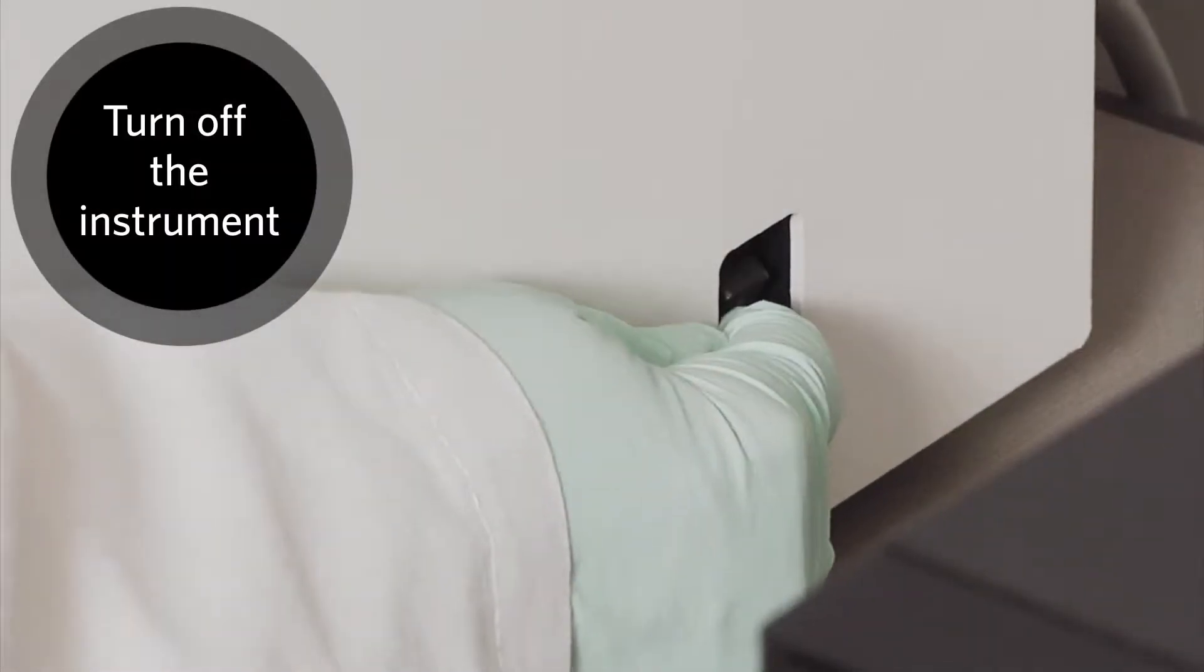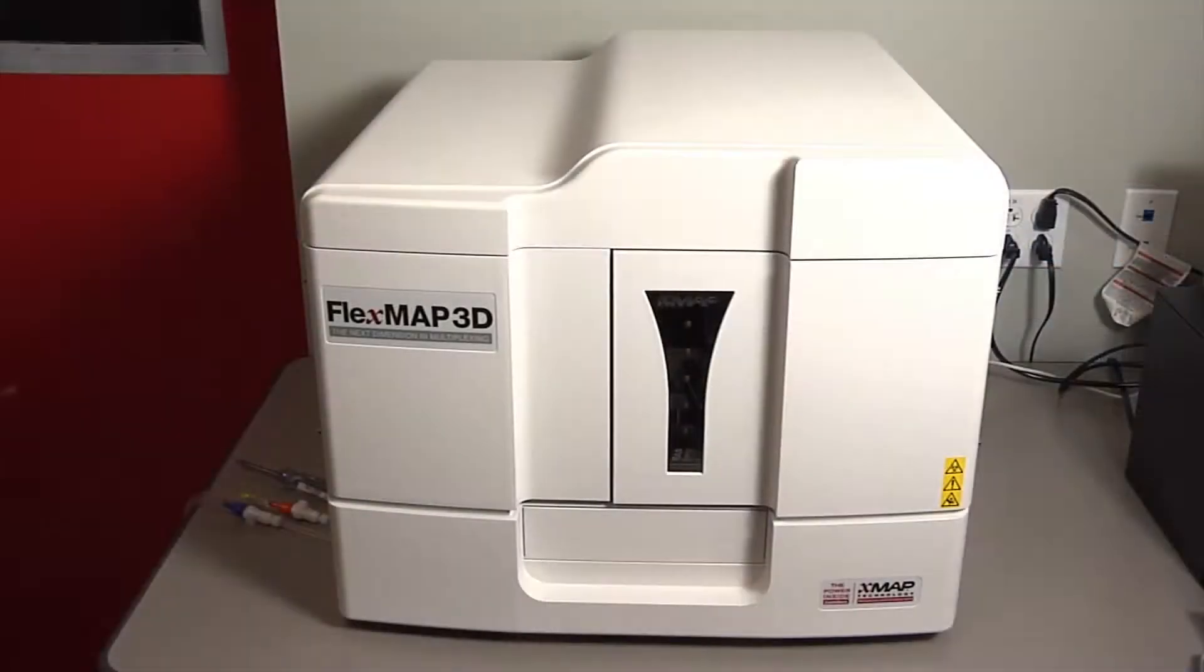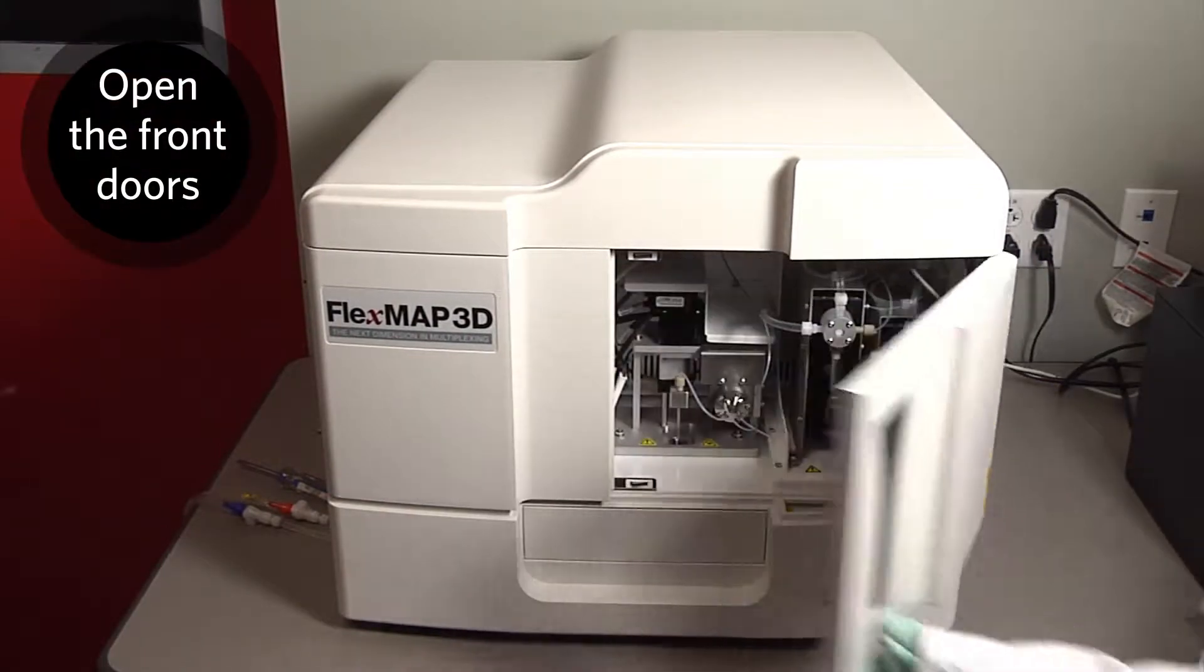Turn off the FlexMap 3D instrument and unplug the power cord. Open the front access doors.